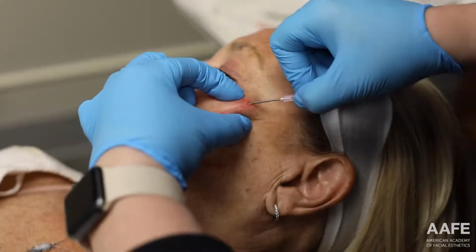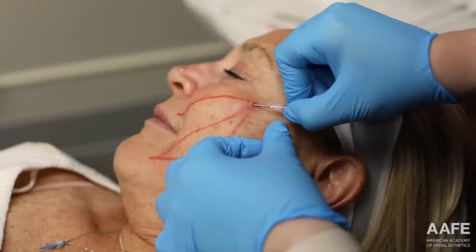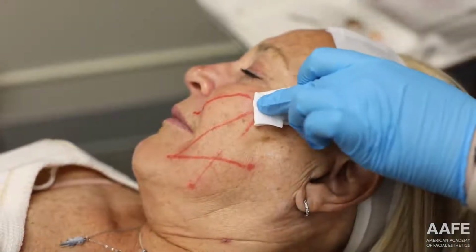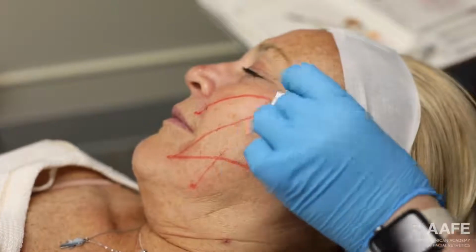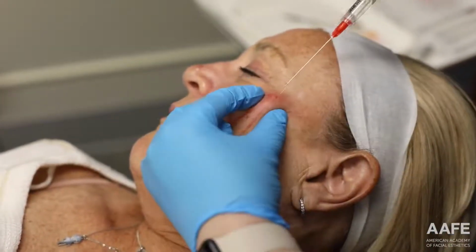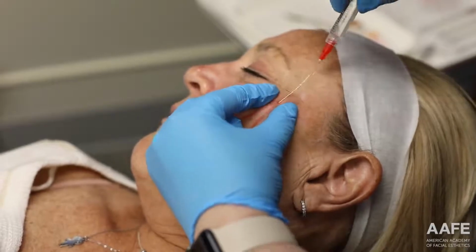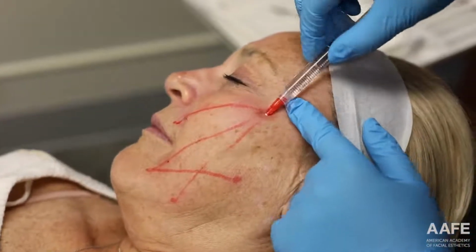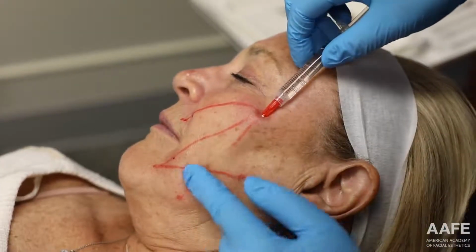So going in with my 18 gauge, pinching up the skin, and like I'm starting an IV, just kind of diving in. Just going in with my cannula. Sometimes you'll struggle to get in there. I like to either pinch up the tissue and kind of dive in, or sometimes pulling it nice and taut backwards, you'll slip in that way. And then it's really easy.